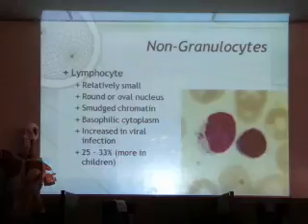Lymphocyte count is generally only about 25%, 30%, 35% at most in adults. In children, preteens, their lymphocyte count tends to be a little bit higher because their lymphoid organs are still growing, they're developing, so they tend to put out more lymphocytes in circulation. So it could be maybe 40%, 50% in circulation for kids. But if you begin to see 50%, 60% in adults our age, then we consider viral infection, virus.